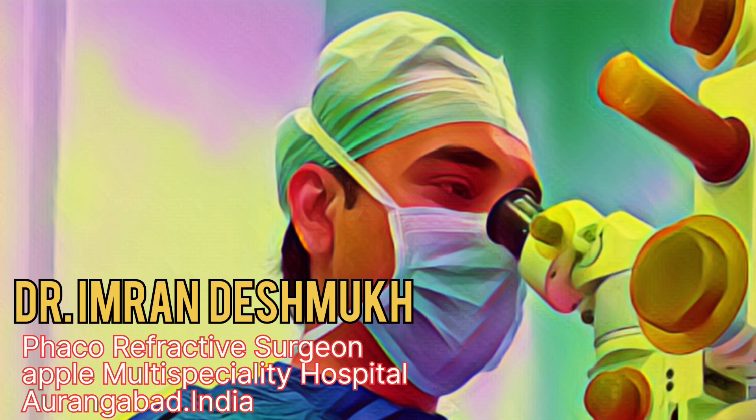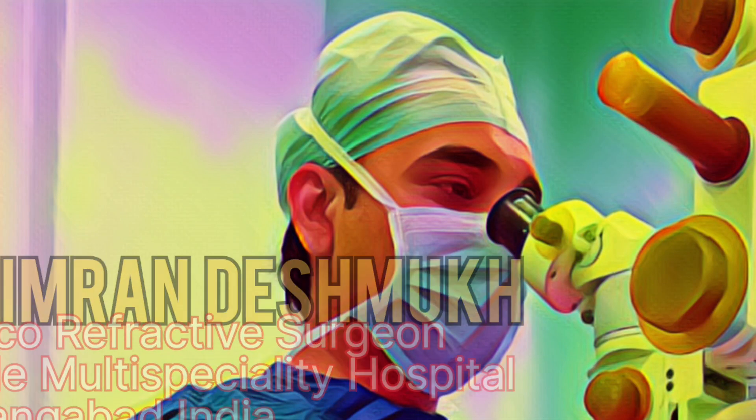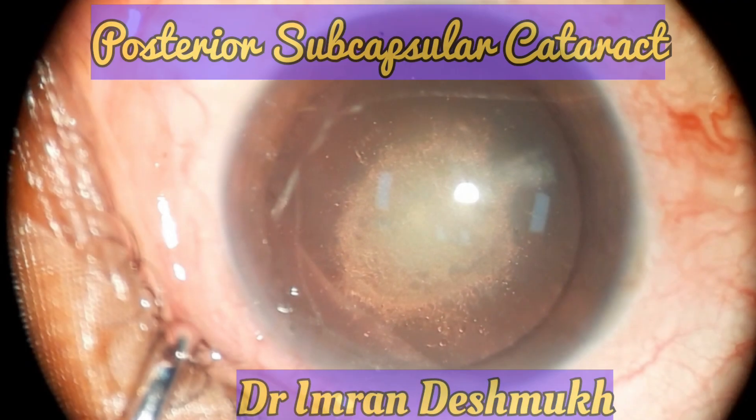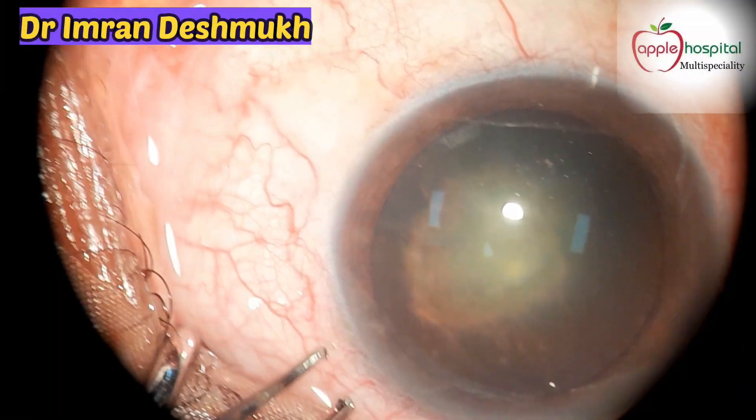Hello everyone, this is Dr. Imran Deshmukh from India, and today we'll be discussing posterior subcapsular cataract — how to approach this case. Usually these cases have a very soft nucleus.